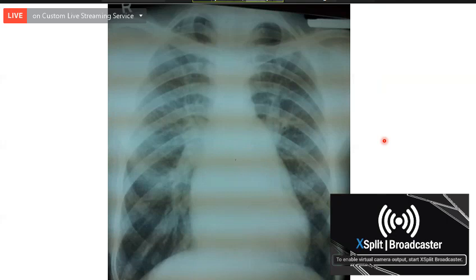The main pulmonary artery is dilated. You can very easily see the four structures which form the left part of the heart. This is the aortic knuckle, this is the pulmonary segment, left atrial appendage, and the rest of the left part of the heart. So you can very clearly see all four structures which form the left heart border. And this is formed by what?